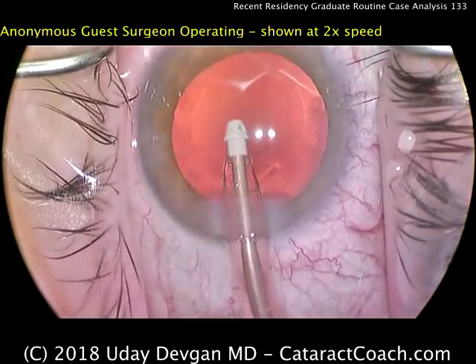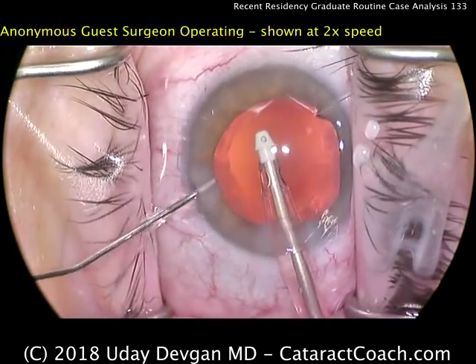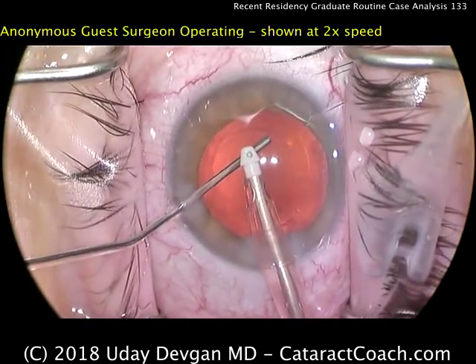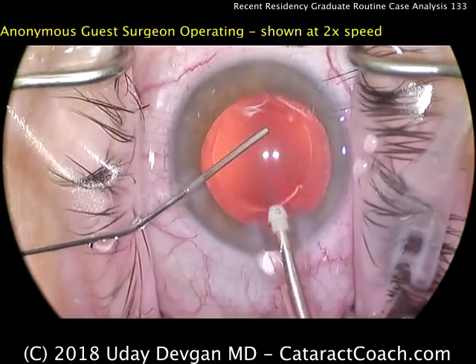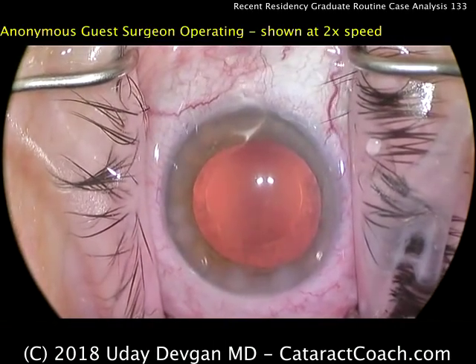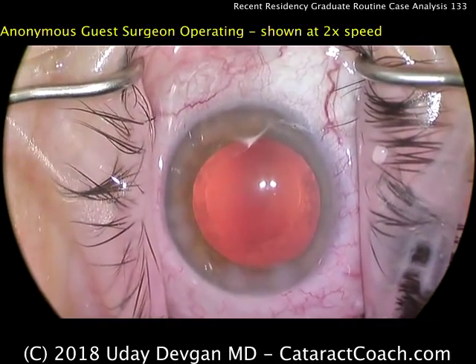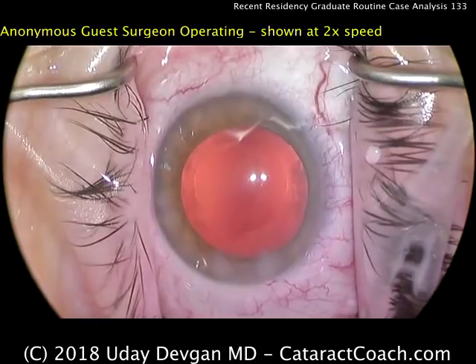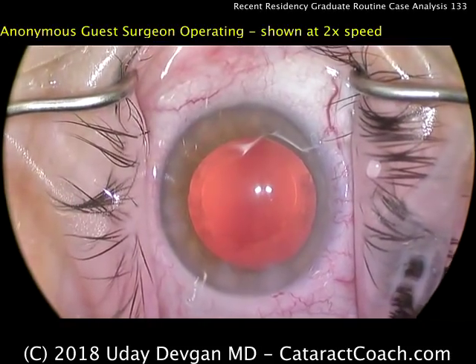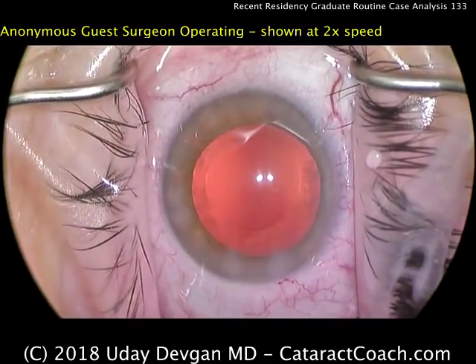Now some of you are wondering: should you polish the undersurface of the anterior capsular rim? I don't know if that's entirely needed. This technique is nice — filling up the capsular bag prior to removing the IA probe from the eye, to prevent the anterior chamber from collapsing. We don't always do that, but in a highly myopic eye, which this may be, there is a benefit — to have stability to the anterior hyaloid face.